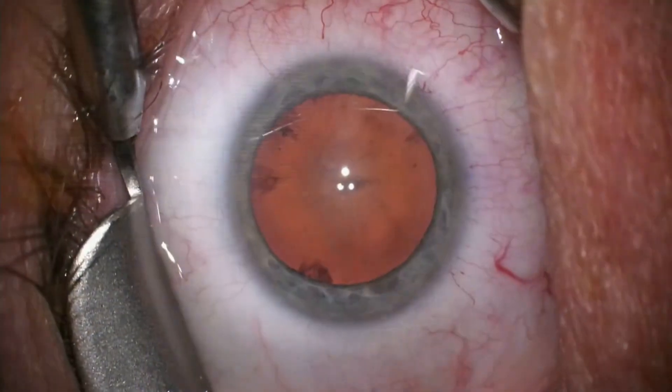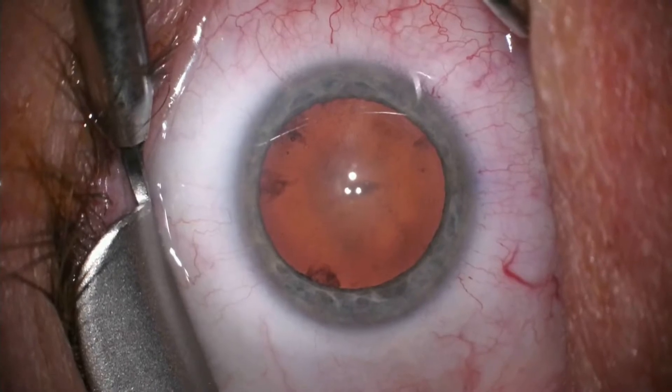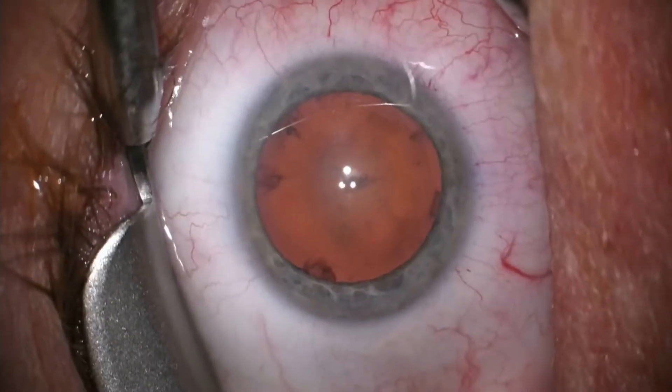I invite you to observe the actual cataract procedure with me as I perform it through our operating microscope. We are now viewing this patient's eye through the microscope and our orientation is from the side at the nine o'clock position.